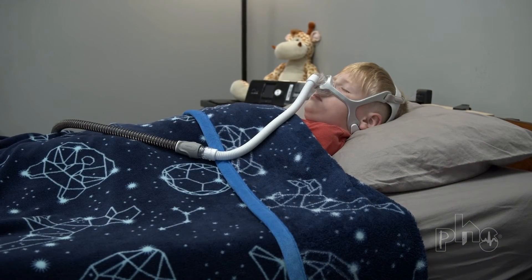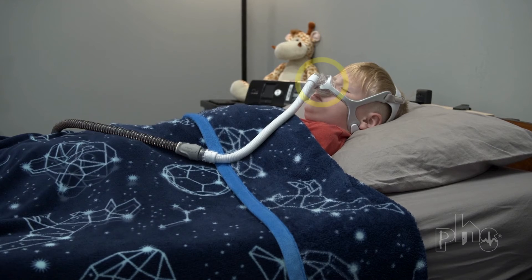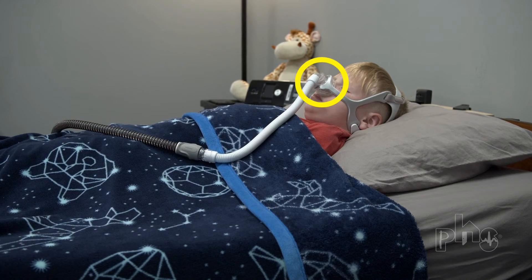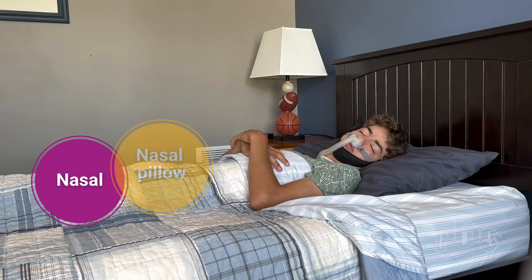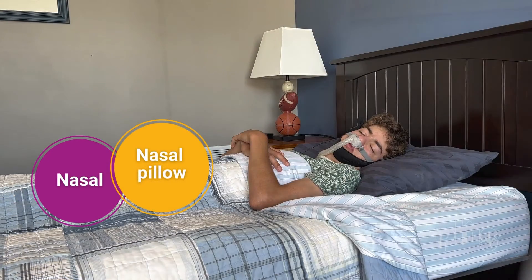Air from the tubing enters the patient's airway and lungs through a mask. Masks usually have headgear to hold them in place and come in three main styles: nasal, nasal pillow, and full face.